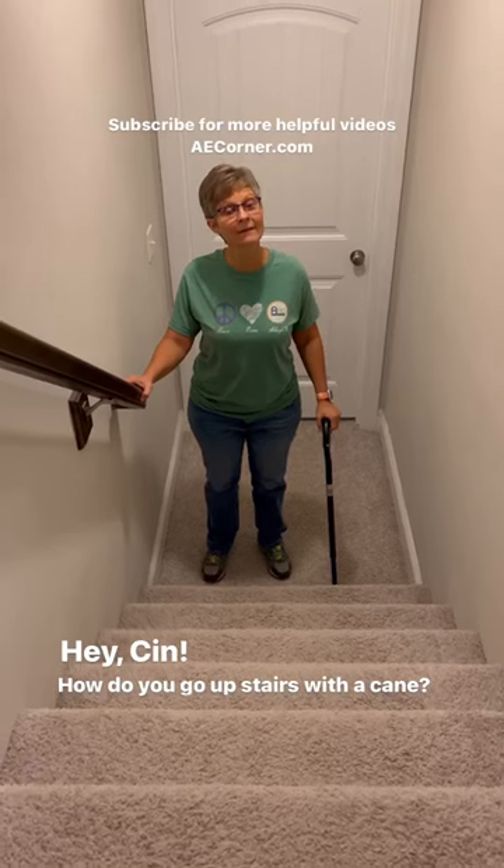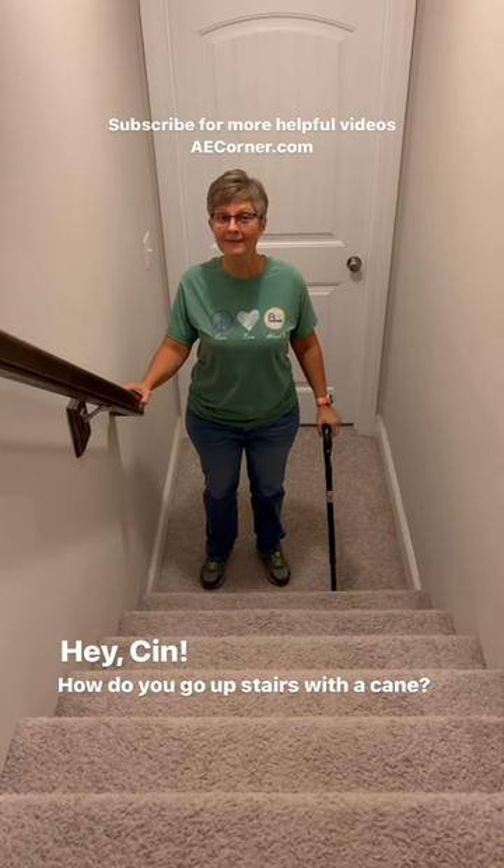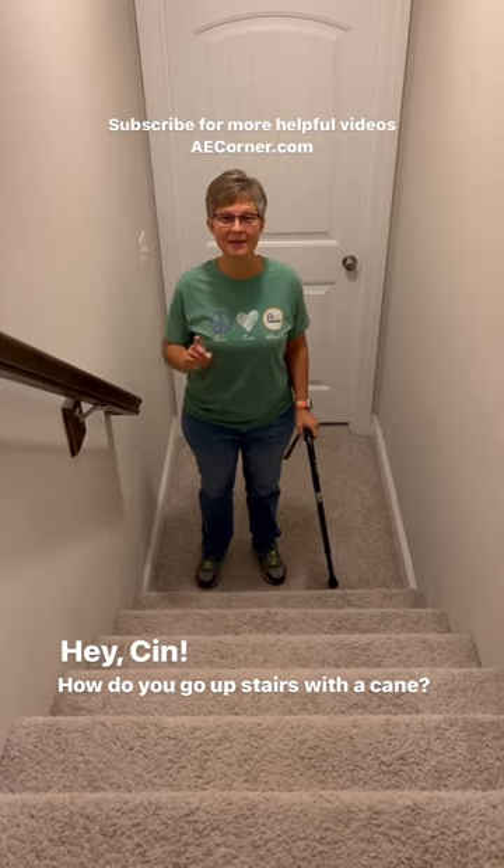Hey, Cyn. Yes? How do you go upstairs with a cane? This is how you do it. Here's your cane. Going upstairs.